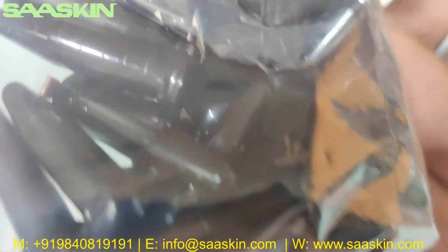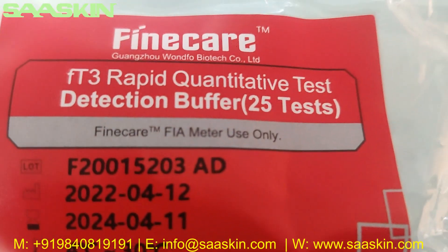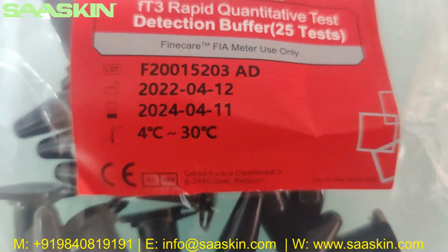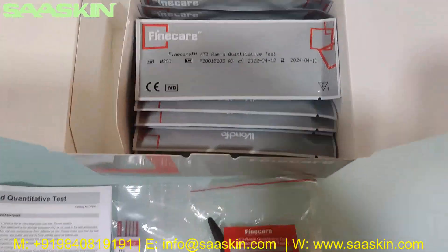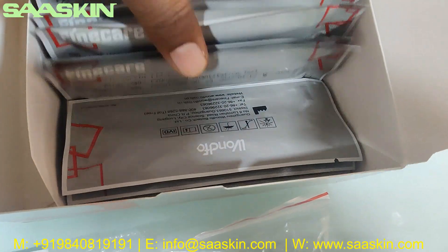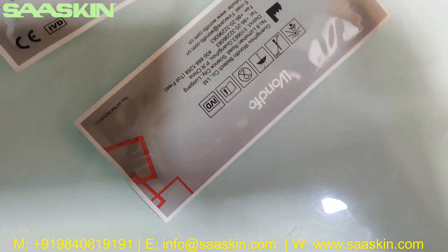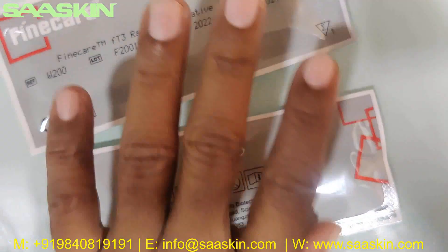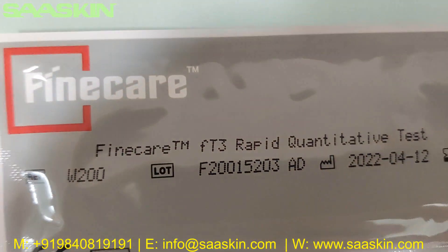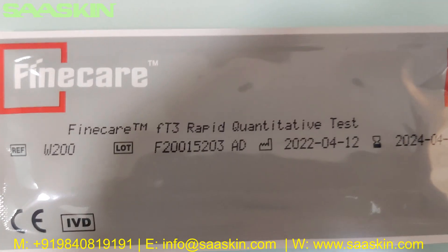Here you can see the Fine Care FT3 Rapid Quantitative Test cartridges — 25 in total. You can see the lot number, expiry period, and storage temperature on the packaging. Let me pull two cartridges out from this. You can see here how the individual pack looks — it says Fine Care FT3 Rapid Quantitative Test.